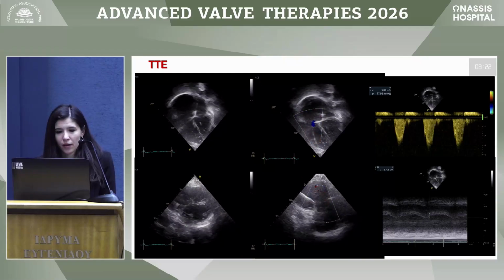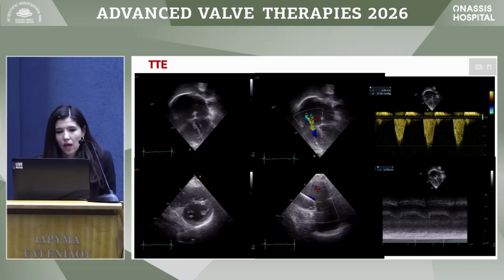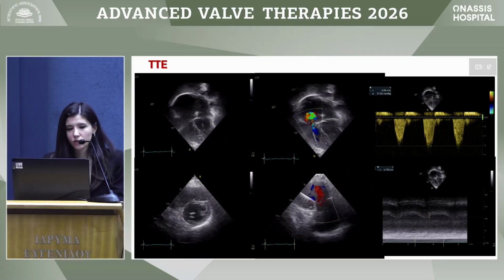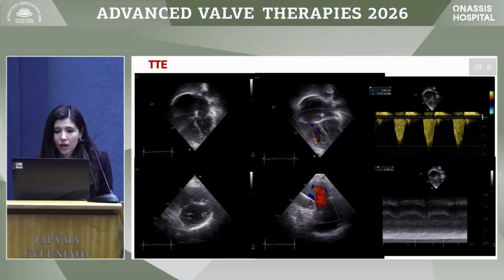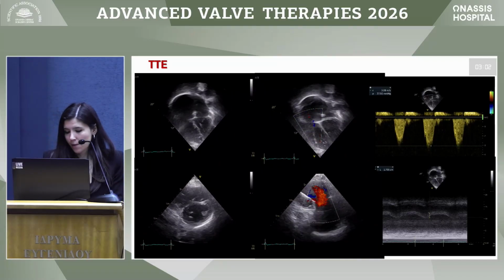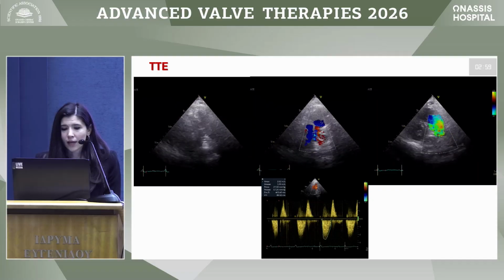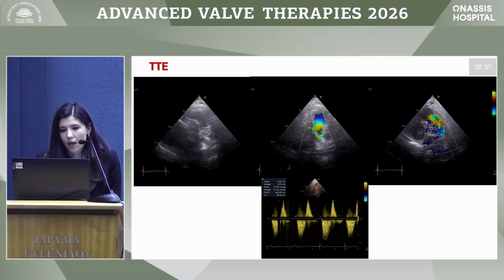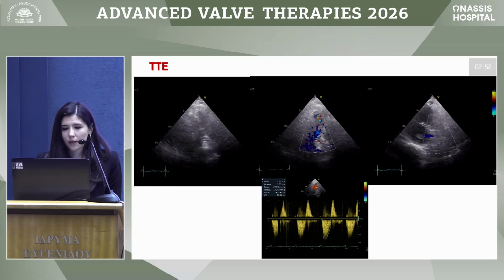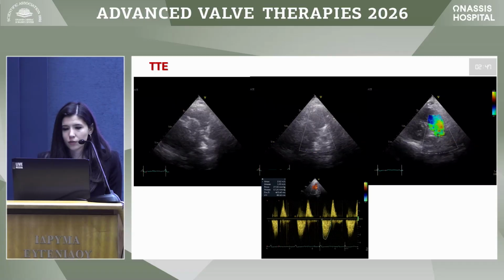So you see from the echocardiogram in our department that the patient has a severely dilated right atrium and ventricle with severe tricuspid regurgitation and impaired right ventricular function. She has a mixed lesion, with stenosis, but her main problem is the regurgitation, which you see is moderate to severe.